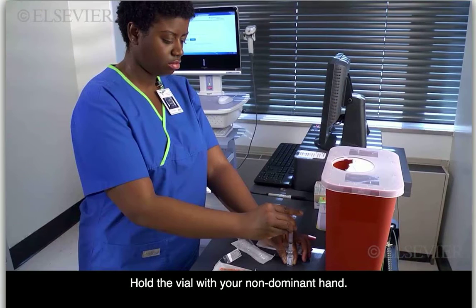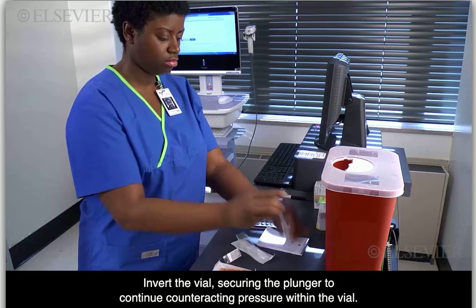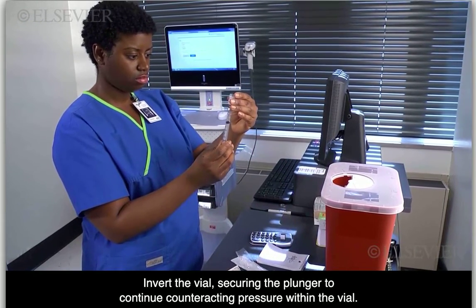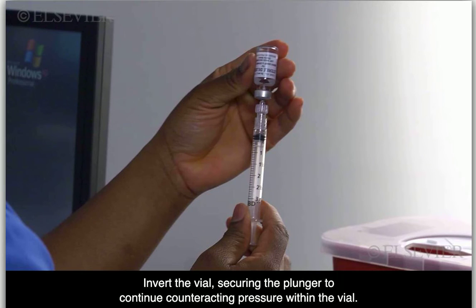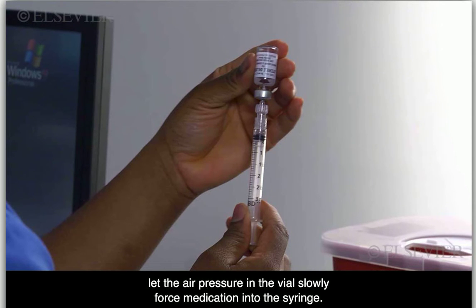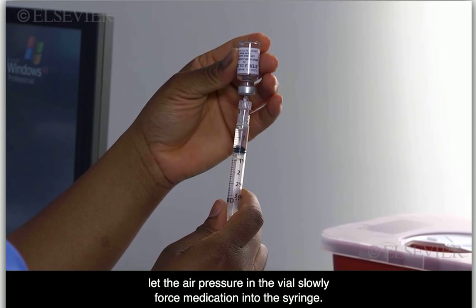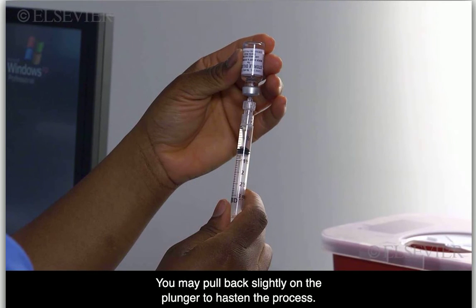Hold the vial with your non-dominant hand. Hold the syringe and plunger with your dominant hand. Invert the vial, securing the plunger to continue counteracting pressure within the vial. Keeping the tip of the needle or needleless device below the level of the fluid, let the air pressure in the vial slowly force medication into the syringe. You may pull back slightly on the plunger to hasten the process.